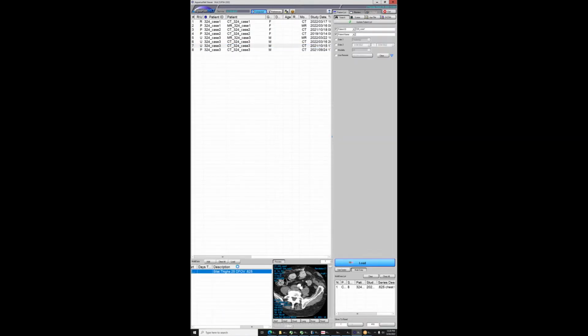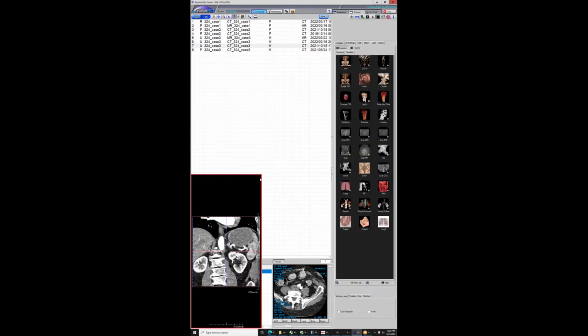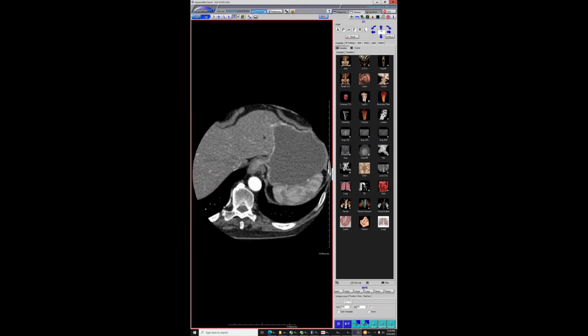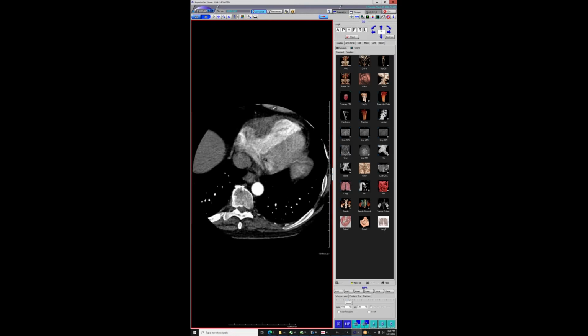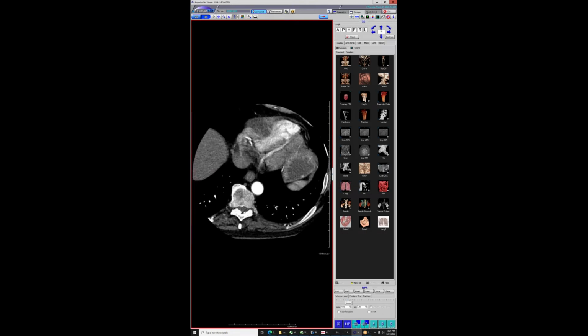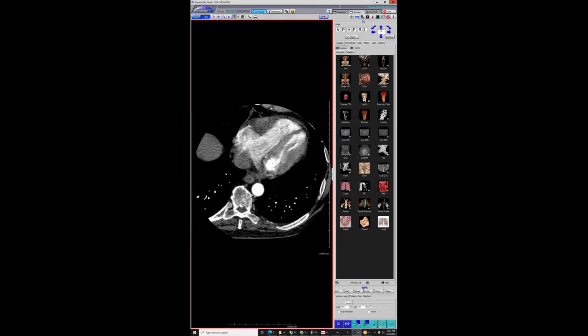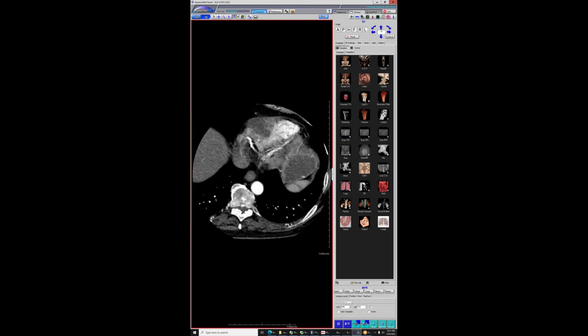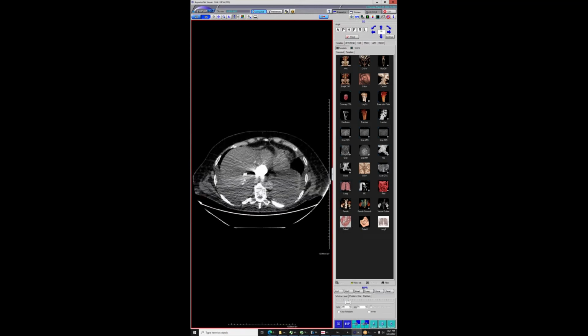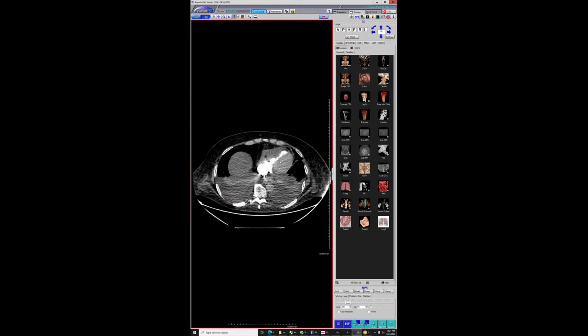It's more conspicuous. Then the patient had a belly CT, an angio runoff. So he had a history of a squamous cell. And then he had a runoff study of the lower extremity, and this was missed as well, which is, I think, a little more conspicuous here. Clearly a mass in the RV with some pericardial involvement. I don't think you can see it on the PE study subsequently, but yeah, this isn't normal either.